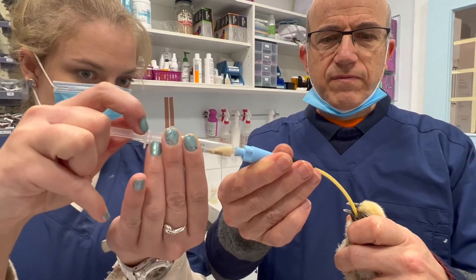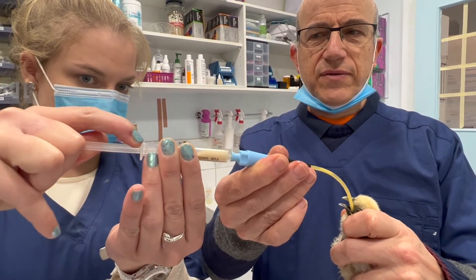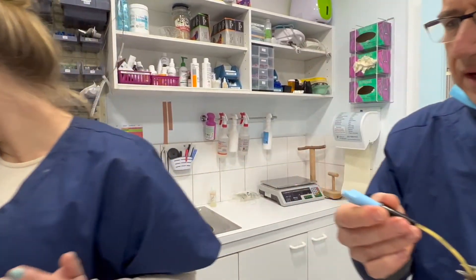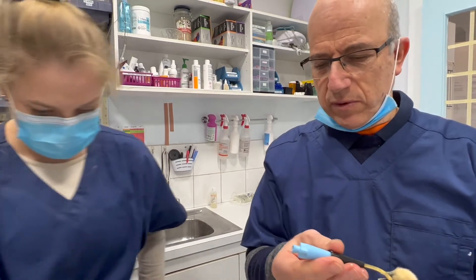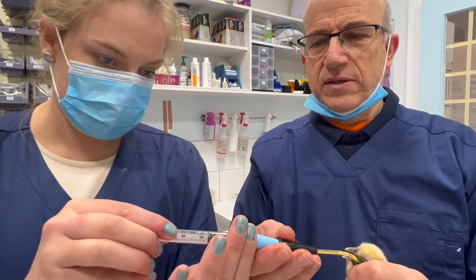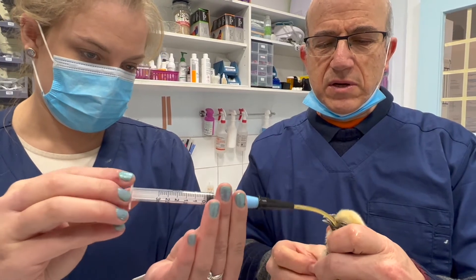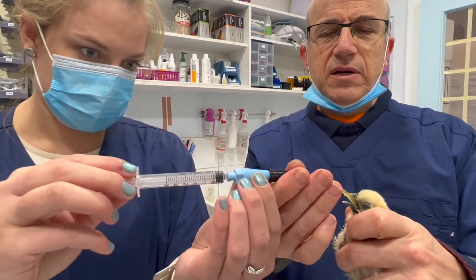So basically you're trying to take out the stagnant mess. Throw that away — take the syringe off, throw that away. Put a new syringe with a bit of fluid. Suck — squirt that in. Keep holding. Okay, suck again.